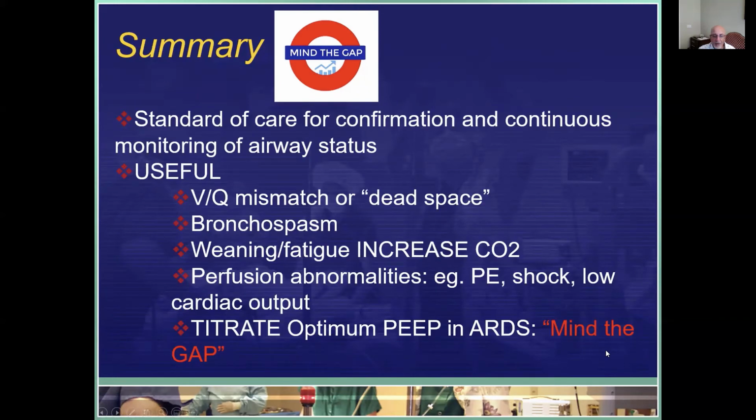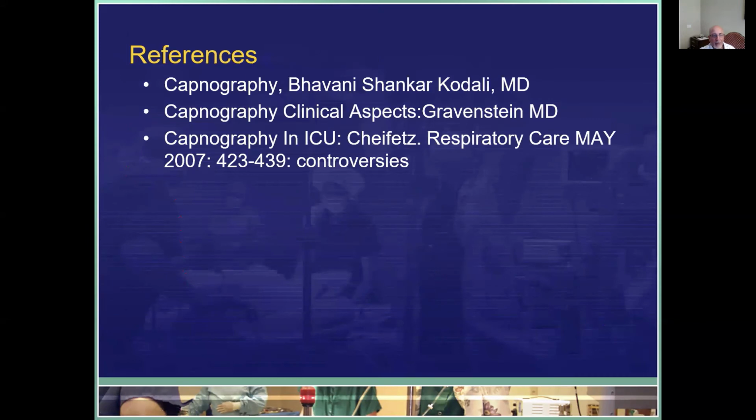I use the term mind the gap, as this difference between PCO2 and end-tidal CO2 is often a sign that dead space is being created with excessive PEEP.